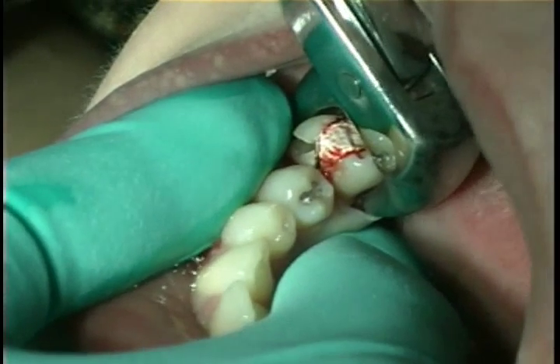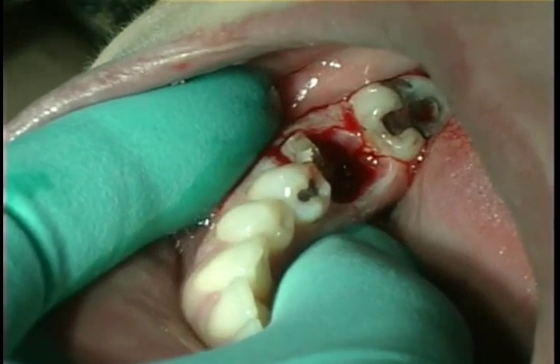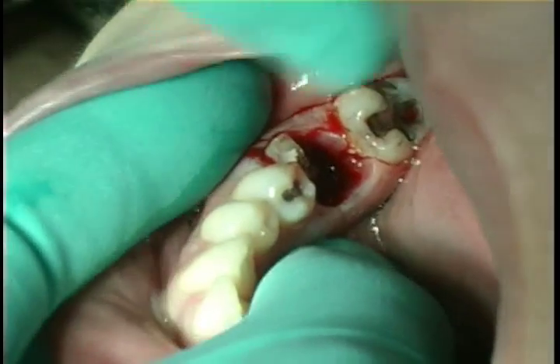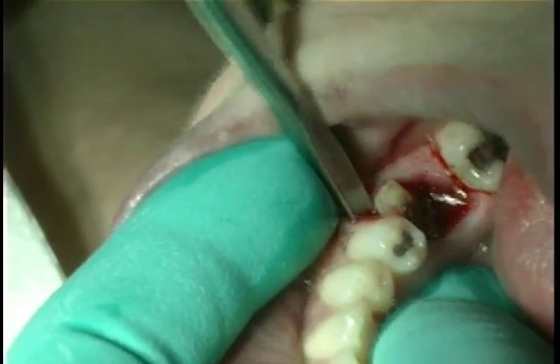Often the fracture will go through the furcation and allow for elevation of the two roots individually. In this case, however, the roots were not fractured and the root complex is therefore elevated in total from the mesial or buccal into the furcation, using the crest of the bone for leverage.